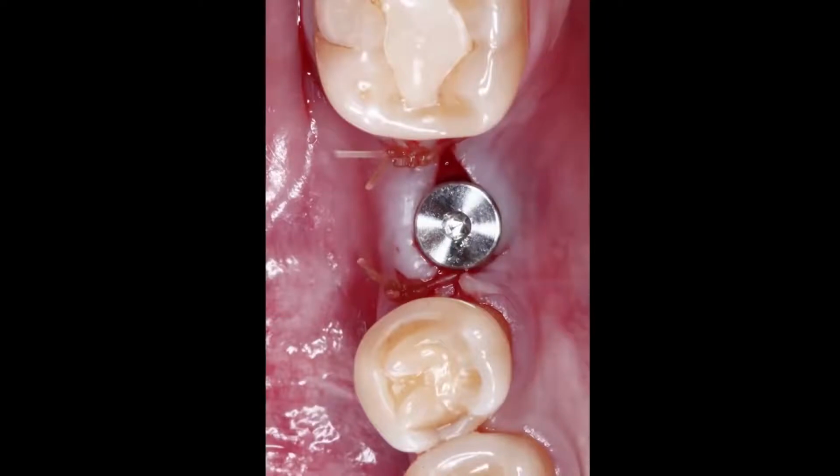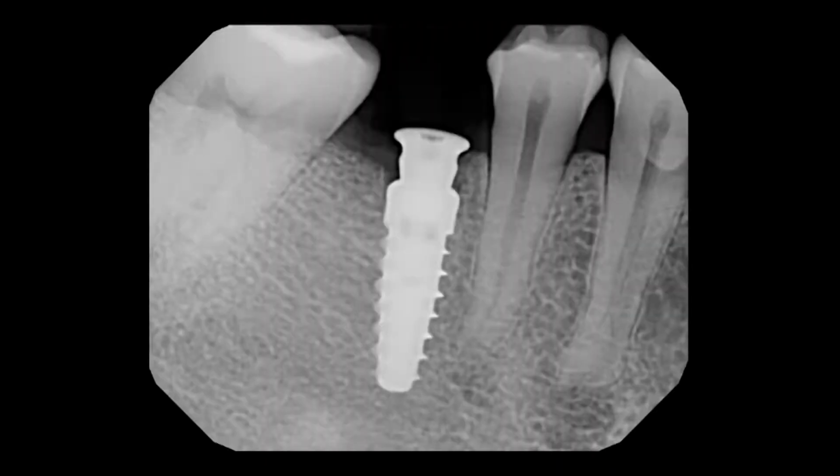And as you can see here, interproximally, I had plenty of space to have the implant in the proper position. And with the final radiograph, you can see that I was able to further upright that implant and place it in proper position for the final restoration.